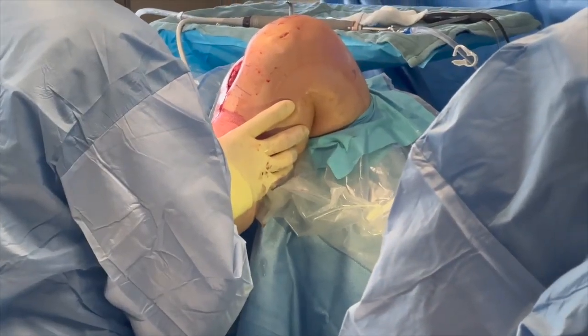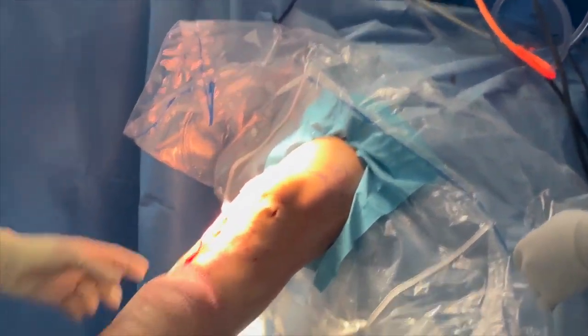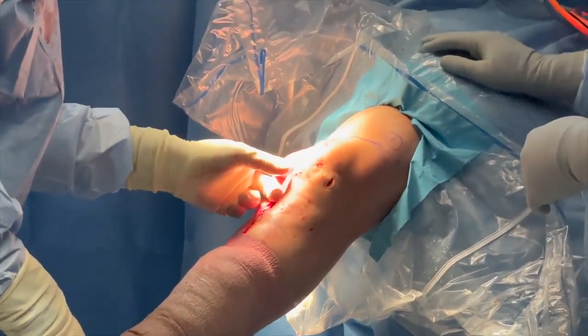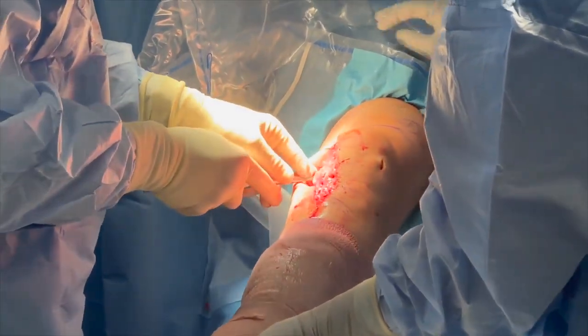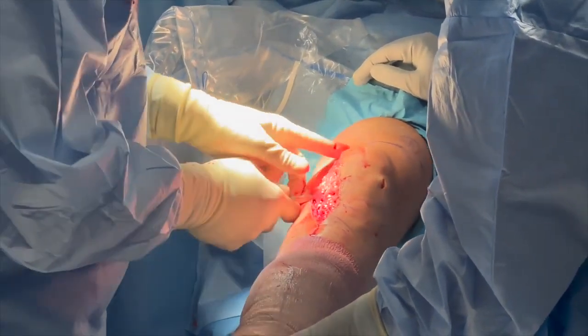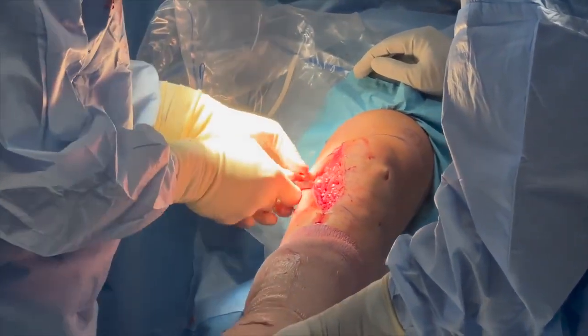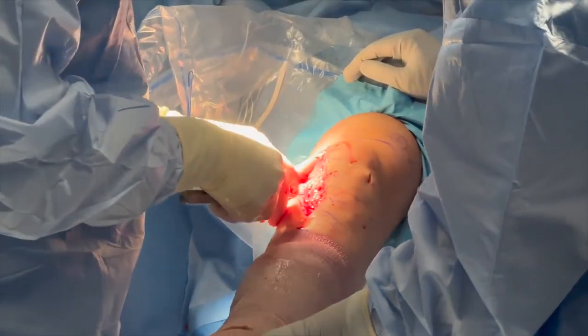Upon manipulation, the patient's quadriceps tendon was found to be tight, so further manipulation was deferred to avoid ligament or tendon damage. After the arthroscopy, an open posterior capsule release is performed through the previously created large anteromedial incision. Capsule release is performed with a Cobb elevator directly against the femur.